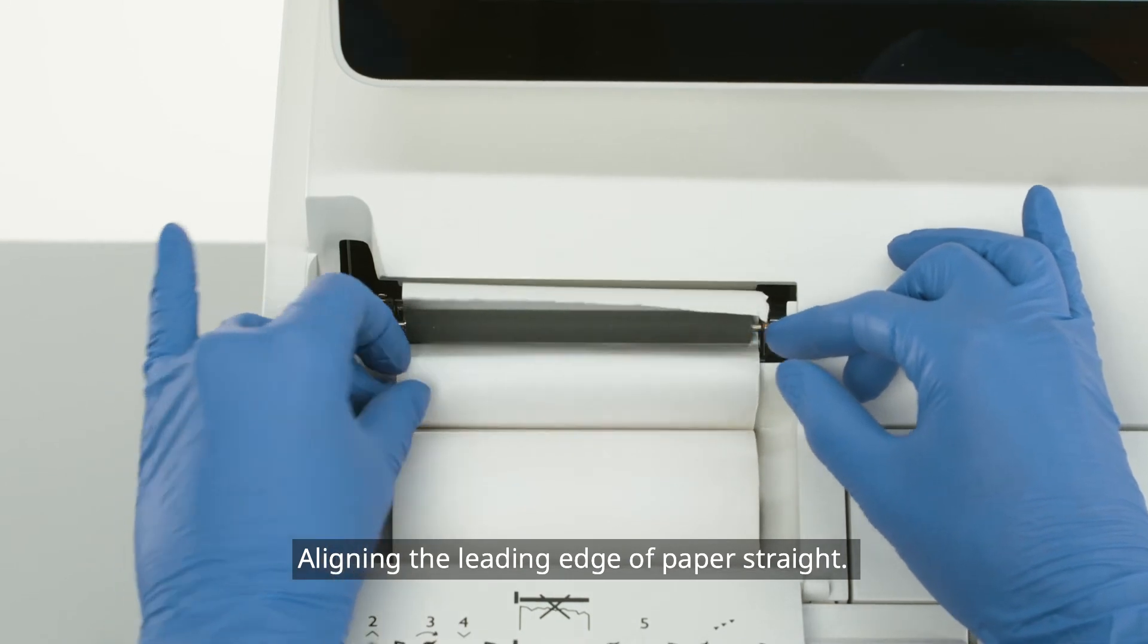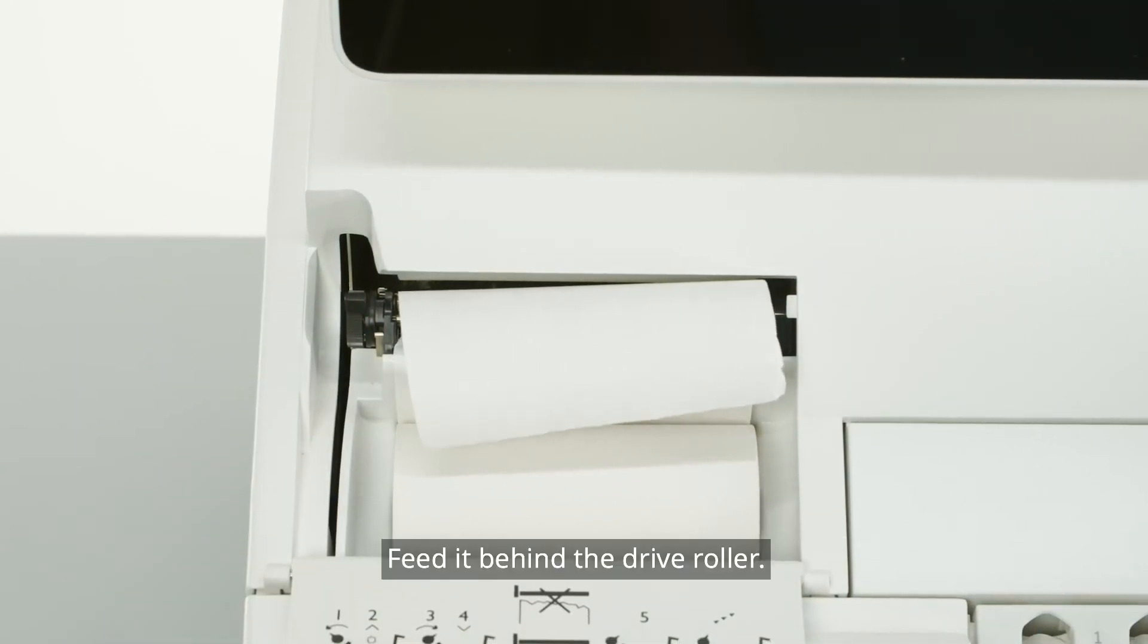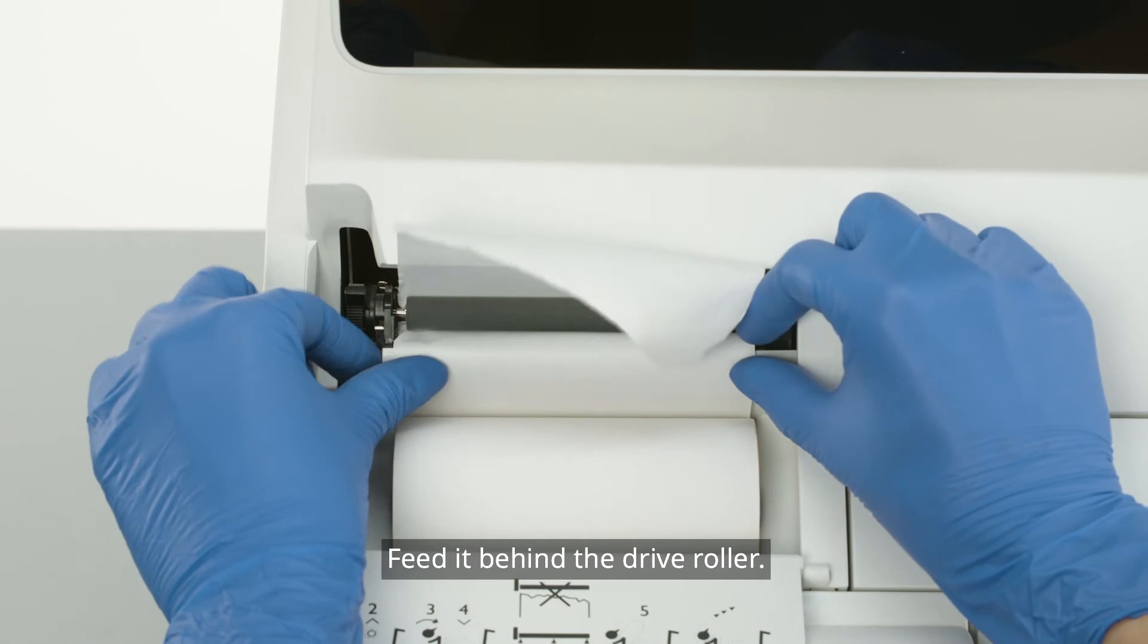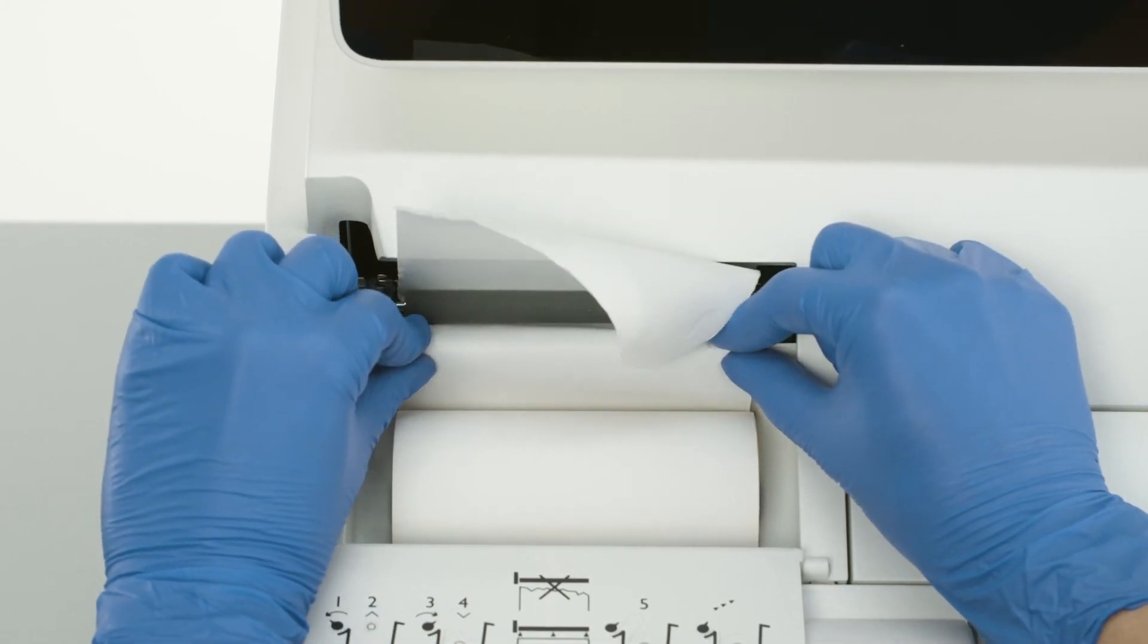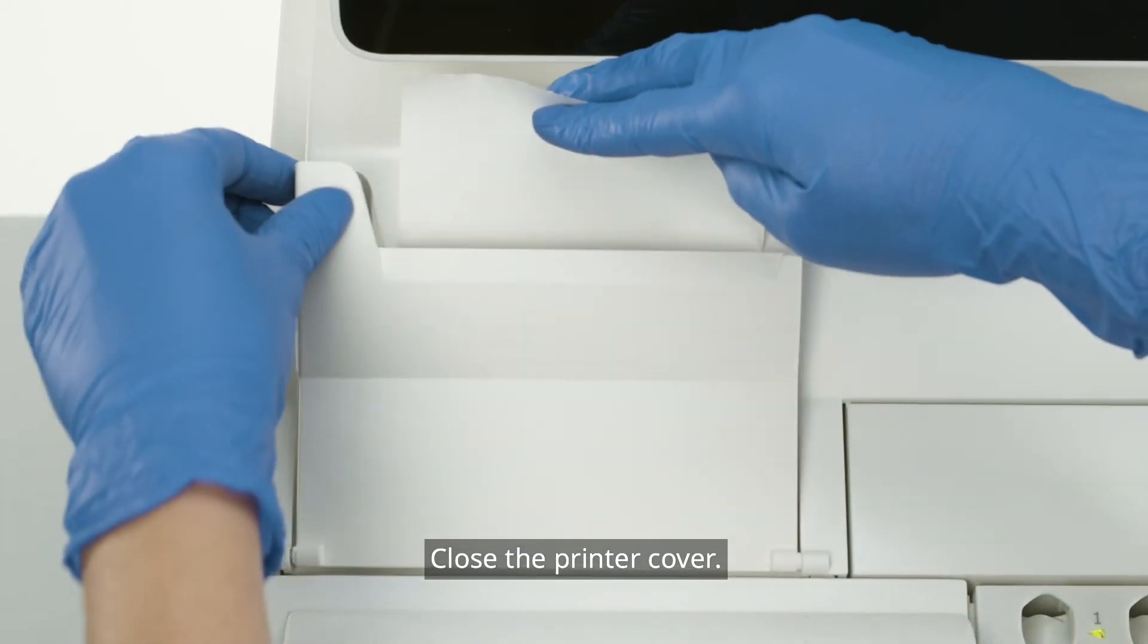Align the leading edge of the paper straight. Feed it behind the drive roller. Close the printer cover.